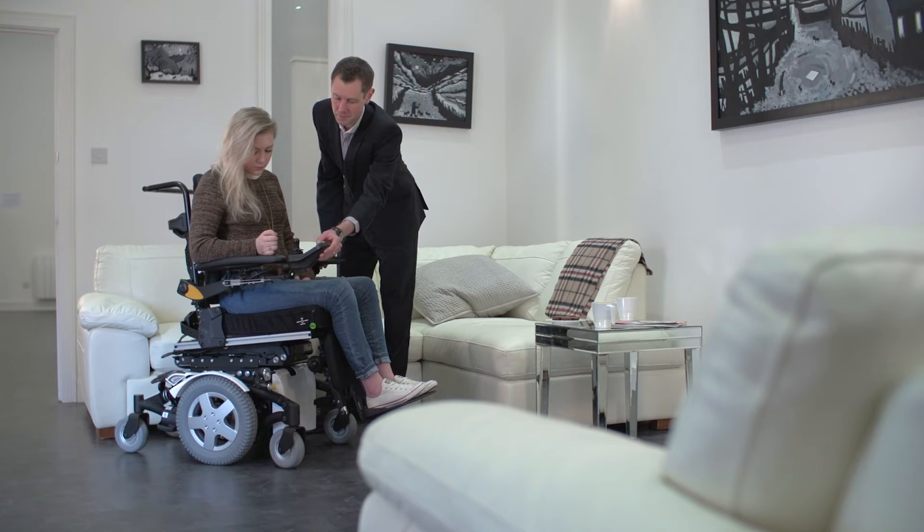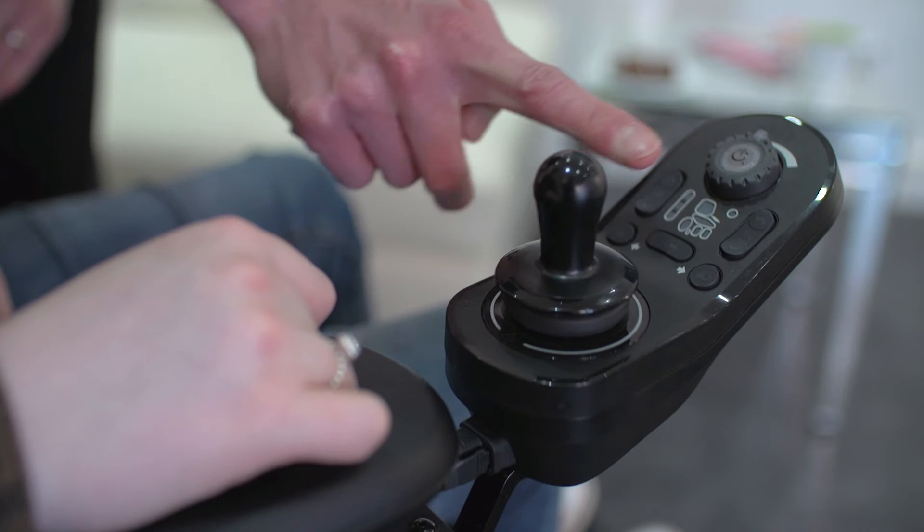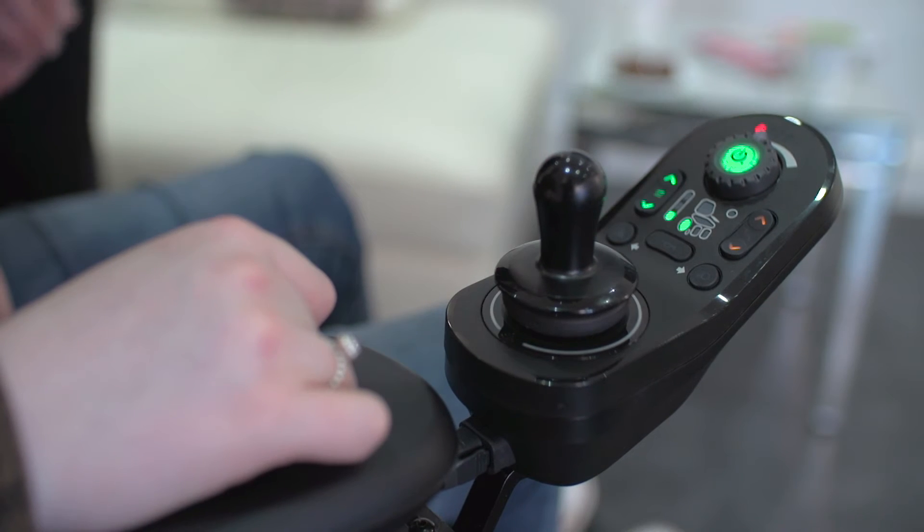The joystick has been ergonomically designed and can be used by a wide range of users. The force required to activate the Lynx joystick is lower than any standard joystick.